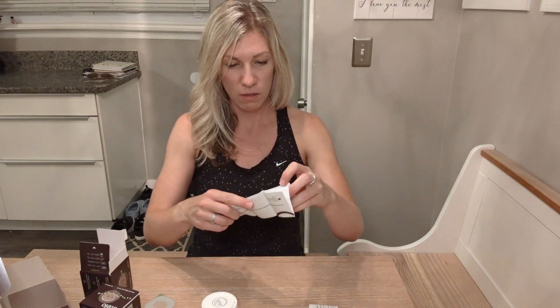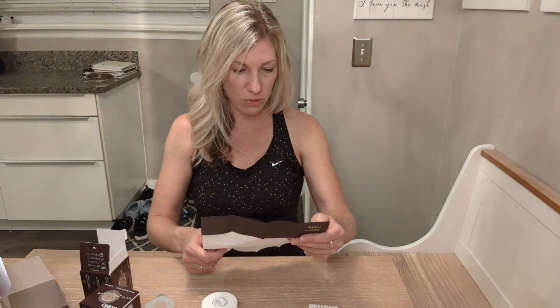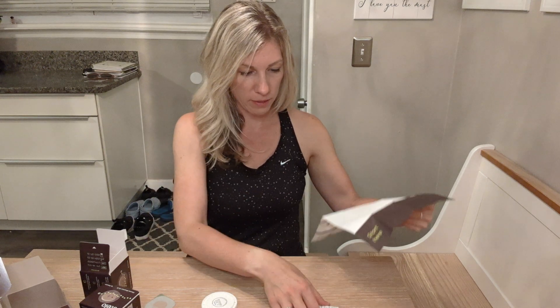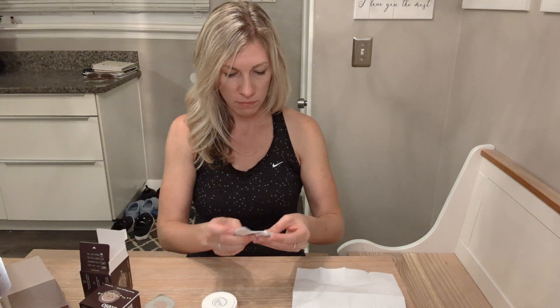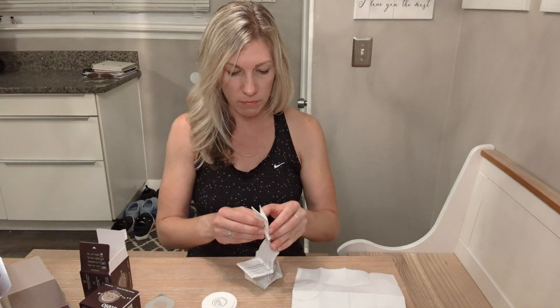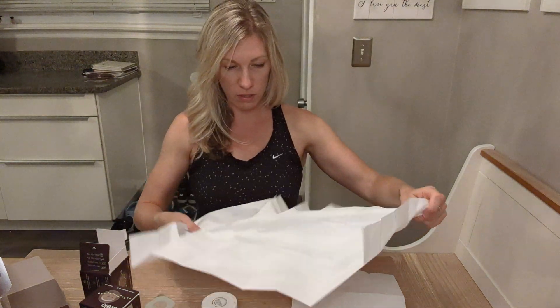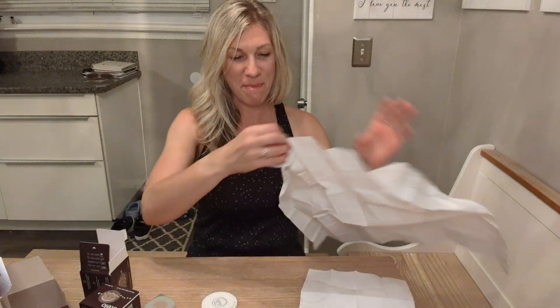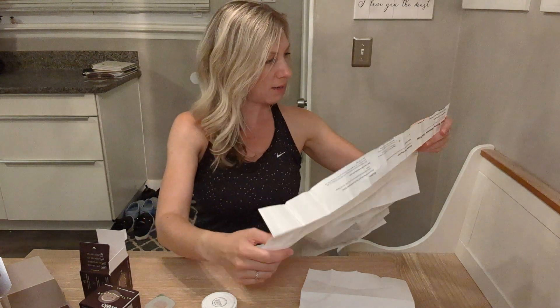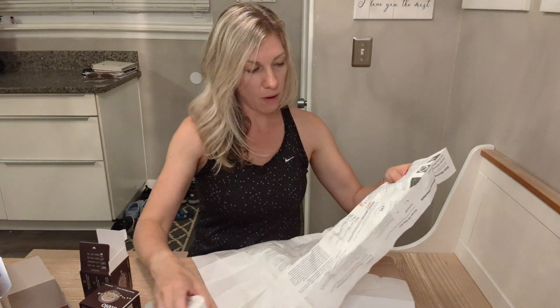There's a nice little start-here booklet. It says if you're just getting started, download the Stello by Dexcom app, which I have done. I'm sure I could follow the step-by-step directions on my phone, but I need my phone to record this, so we're going to go through the old-fashioned map directions. It says: choose your sensor site — insert your sensor on the back of your upper arm.